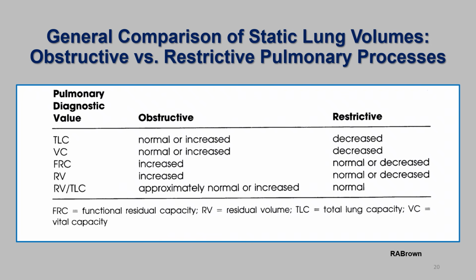Total lung capacity, TLC, is useful for differentiating types of lung disease processes characterized by airflow limitation, for example, obstructive lung disease, which have similar forced expiratory spirometric configurations, whereas chronic bronchitis has near normal TLC, mild to moderate asthma has reversible hyperinflation, and emphysema has irreversible hyperinflation. Hyperinflation is characterized as an increase in the RV to TLC ratio.